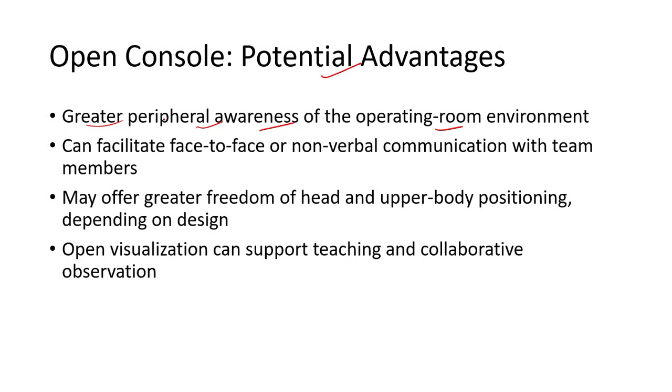It can also facilitate face to face or non-verbal communication with team members, whoever is supporting the case, like an assistant or a scrub nurse, while using the open console.